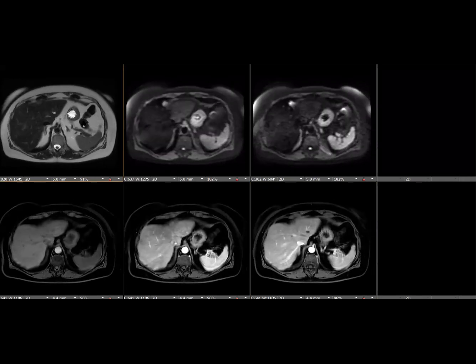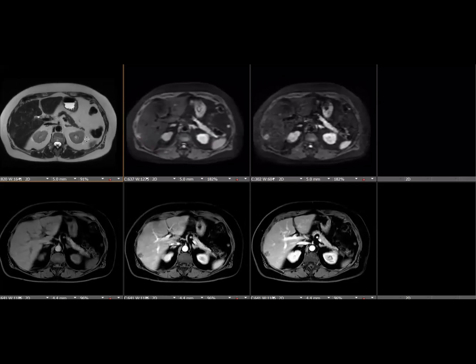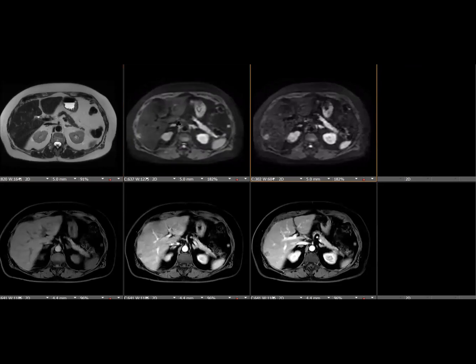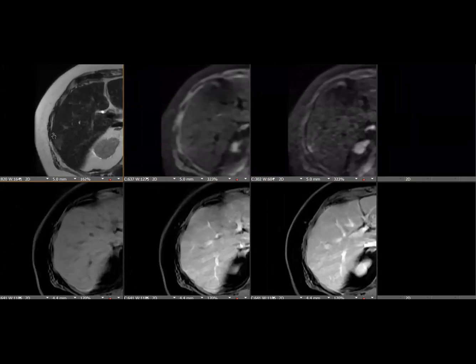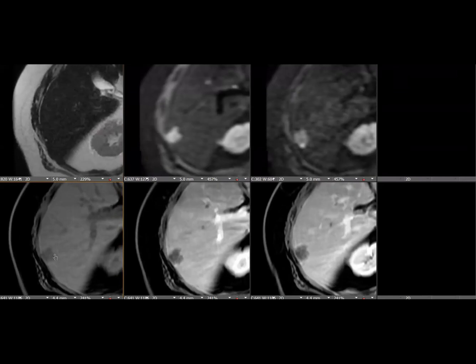This is a case that we presented at HCC, and I hadn't seen this before, so I wanted to share this. So there's a liver lesion here. There's the DWI, and on T2, it's like I love Aarti's evil gray descriptor. So what do you guys think?